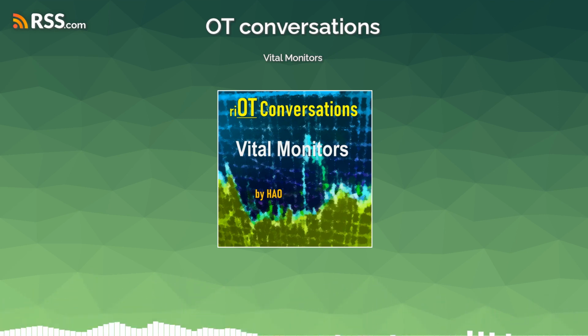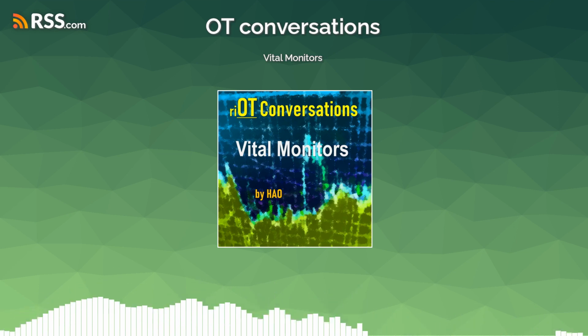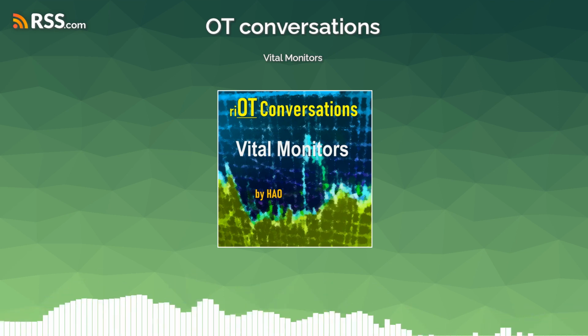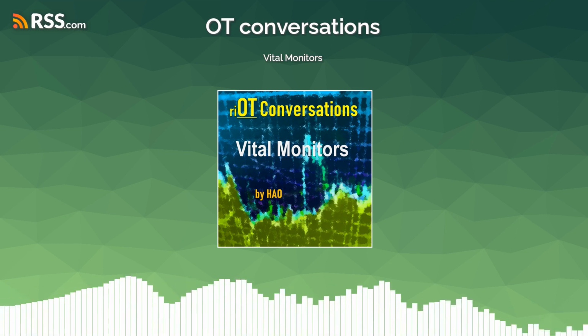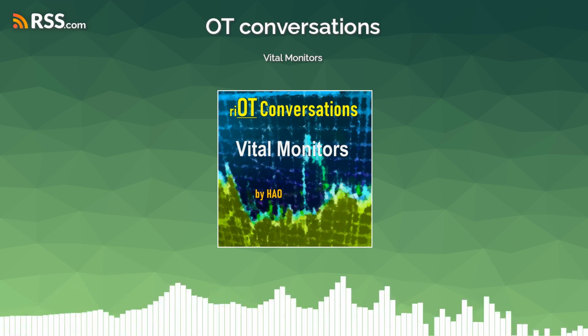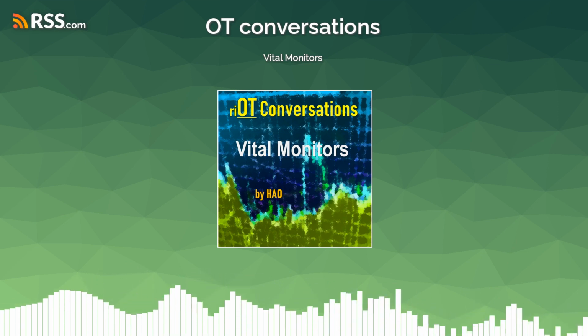There are acceptable and safe ranges for these three physiologic indicators, and they can be set in the unit. So sometimes it sounds an alarm at a certain heart rate or a certain respiratory rate, or equally when it is at the lower limits as well. Sometimes if the sensors are malfunctioning, it can also identify that.